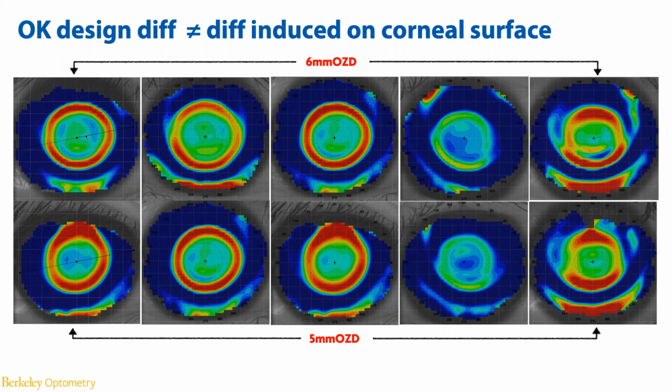So my initial lens selection, I will not change the landing zone angle. But if I see the patient presented with excessive edge lift or insufficient edge lift, I do actually take into consideration that each degree of landing zone angle change will cause a slightly different change in the overall sag of the lens, due to a wider distribution on the landing zone area.